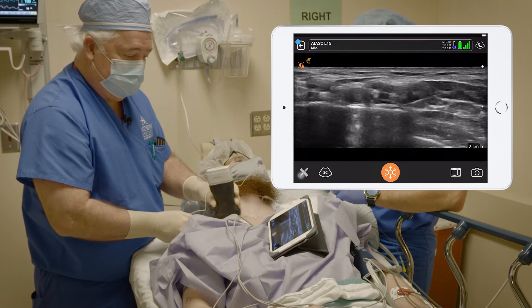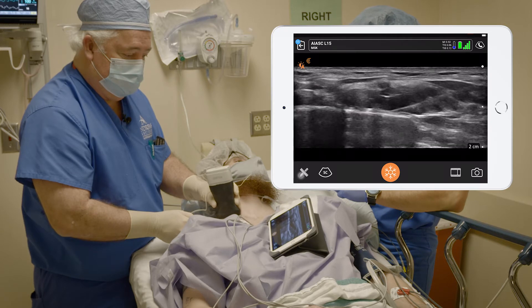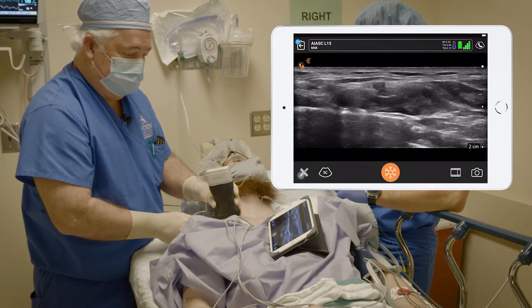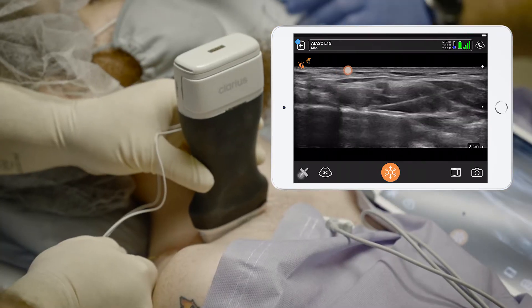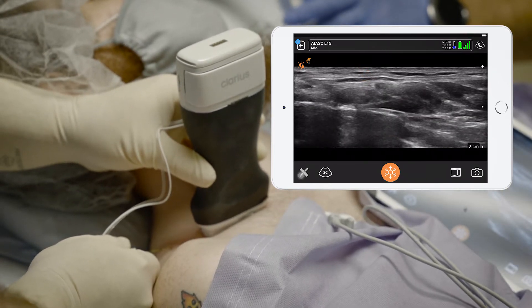Aspiration's negative. Injecting one, two, three, four, five. Good. I want to advance a little bit more, get closer to the artery here. Give us five more, Rocky.